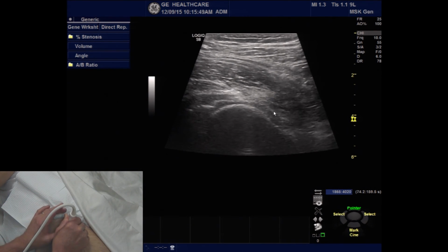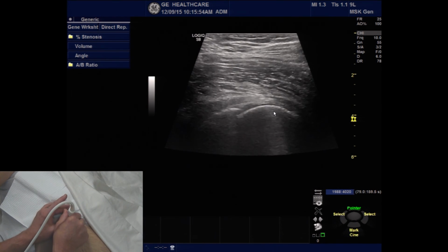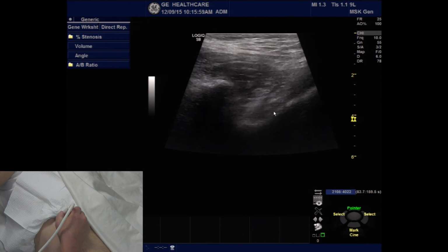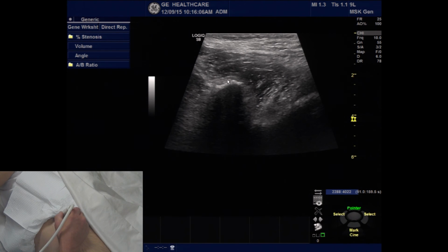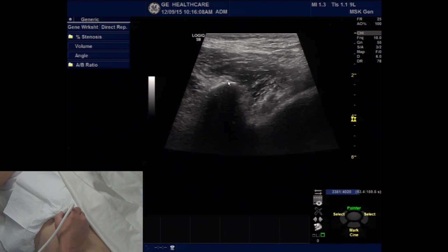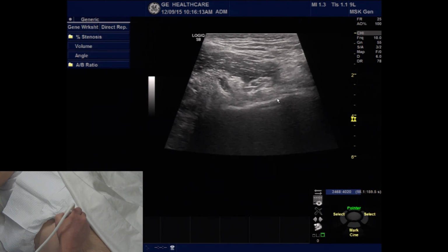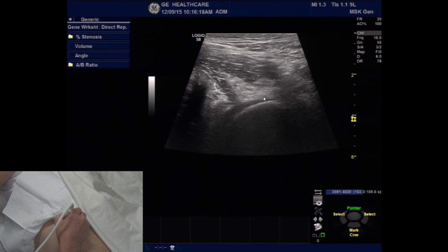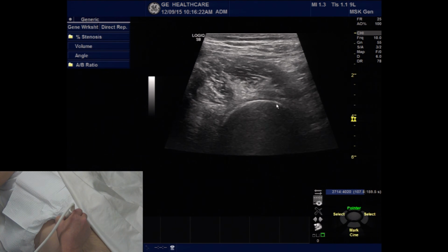Once again, the technique: slide the transducer up, turning the transducer in a counterclockwise fashion, finding the anterior inferior iliac spine and the direct head of the rectus femoris, sliding the transducer inferiorly. We'll pick up the ridge of the acetabulum. We'll see the iliopsoas tendon and the rounded head of the femur.